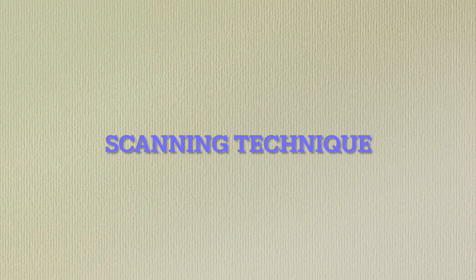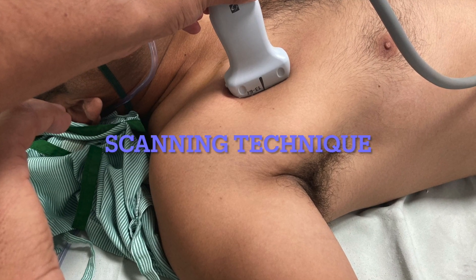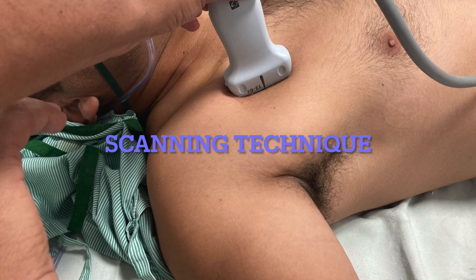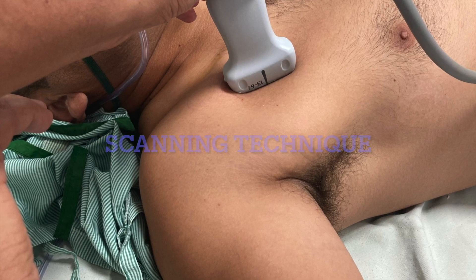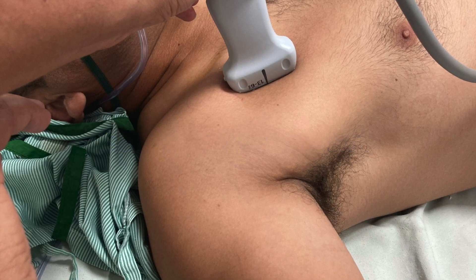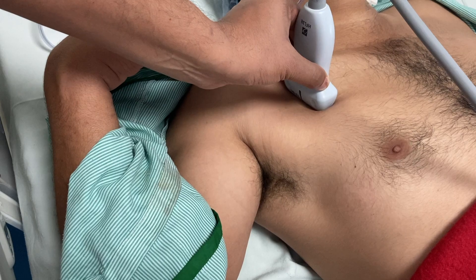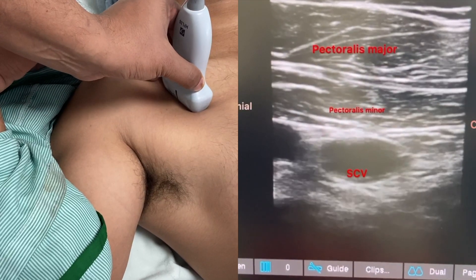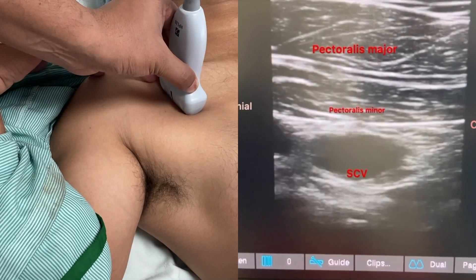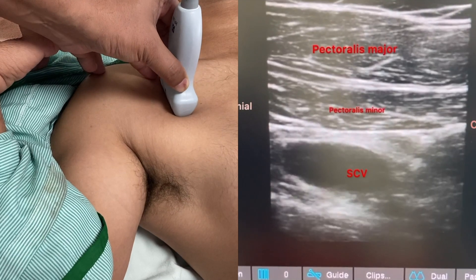Scanning technique: first, place the high-frequency linear probe just below the lateral one-third of the clavicle in a parasagittal plane, then rotate it slightly toward the axilla, keeping both the vein and artery in view.